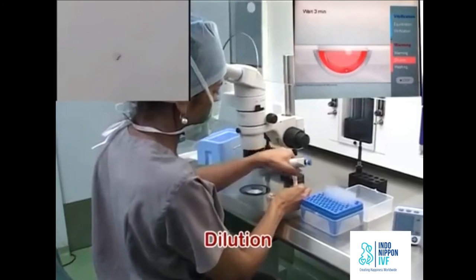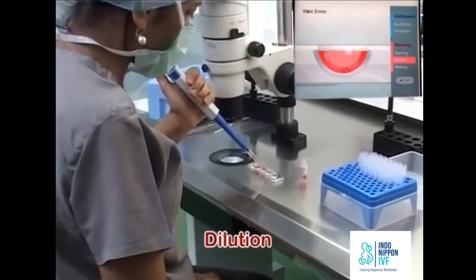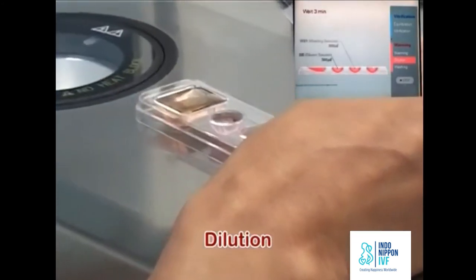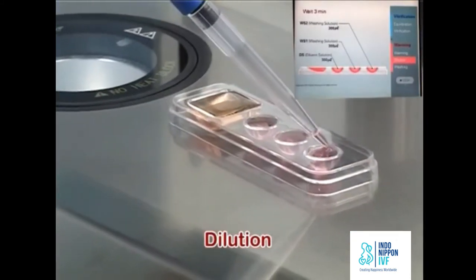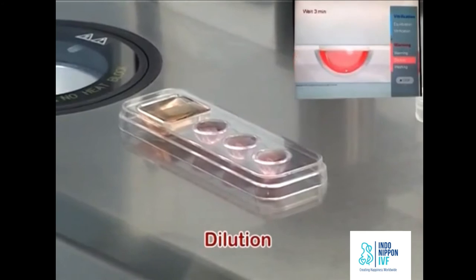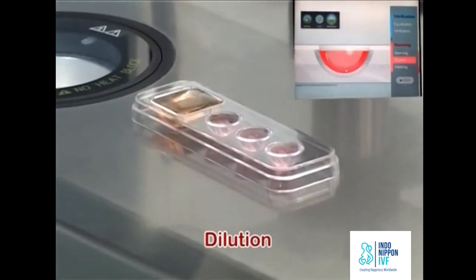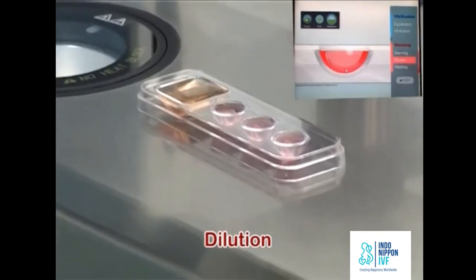While waiting, fill the WS1 and WS2 wells with 300 microliters of washing solution.